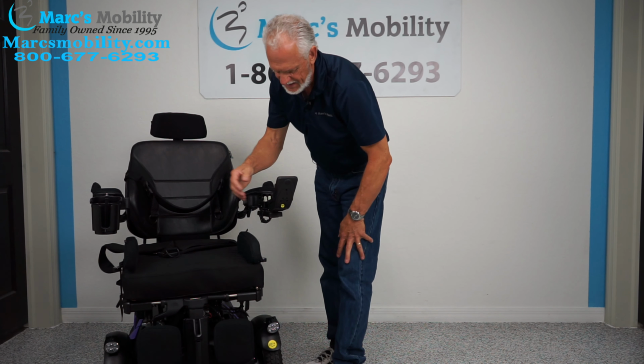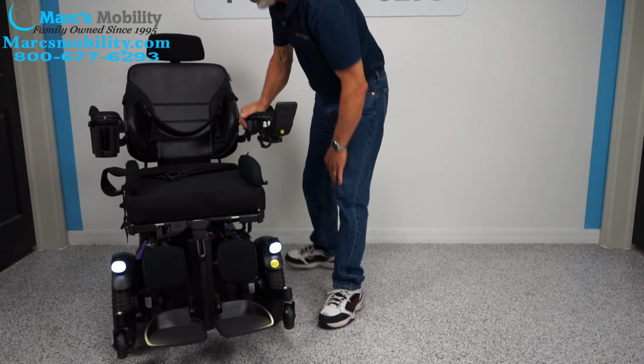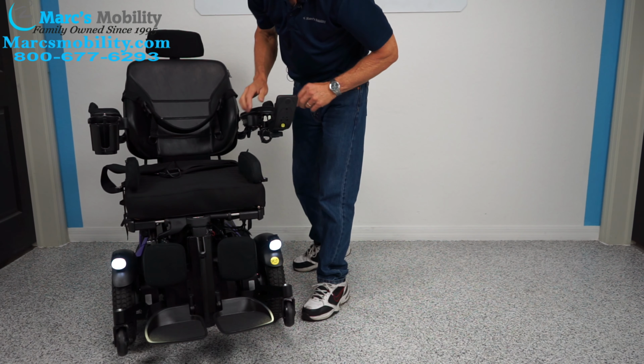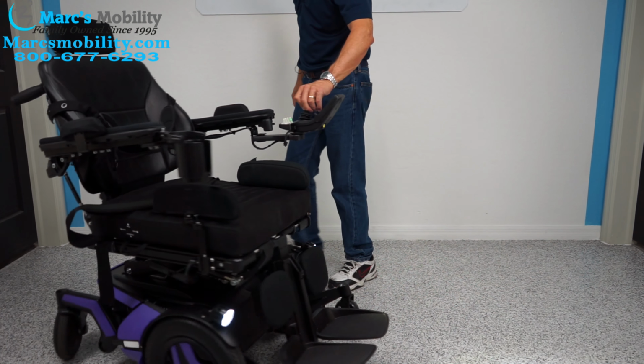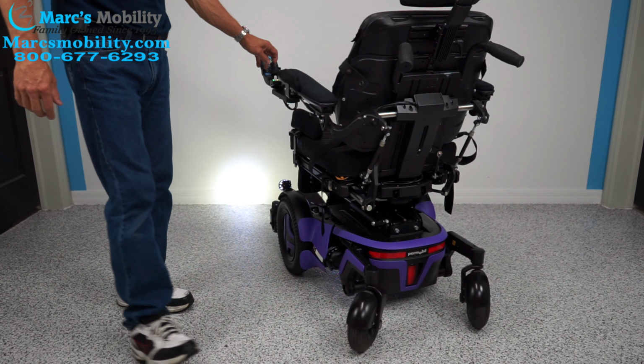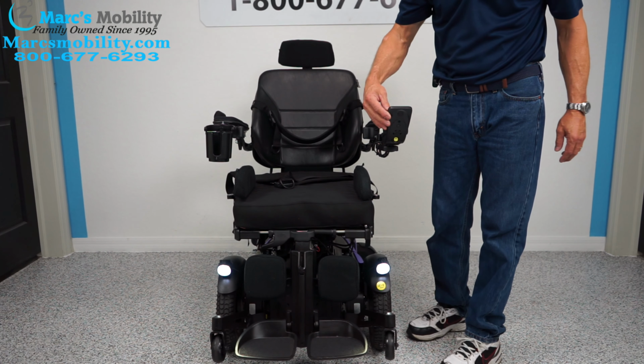You have headlights, and the headlights can be turned on right here. And these are the good ones. These are really good headlights. So this chair only has headlights. It does not have tail lights. But you can see when I turn the chair around, you can see how good those lights are. You can see right there, it'll light up several feet in front of your chair. So it does have headlights that work through the joystick.